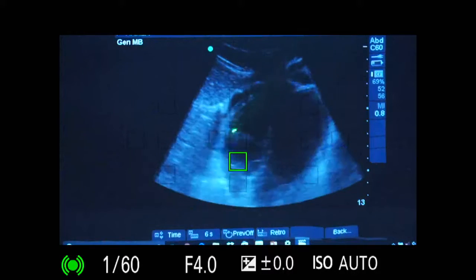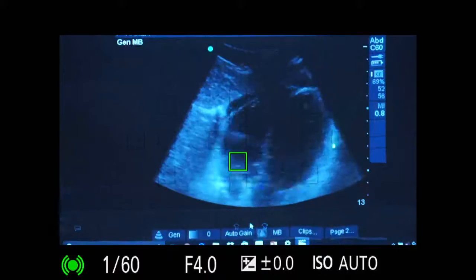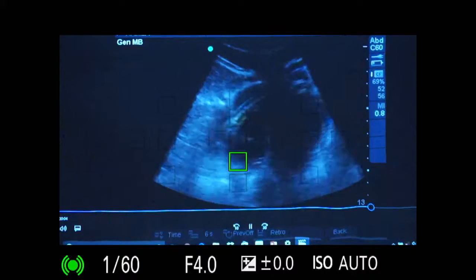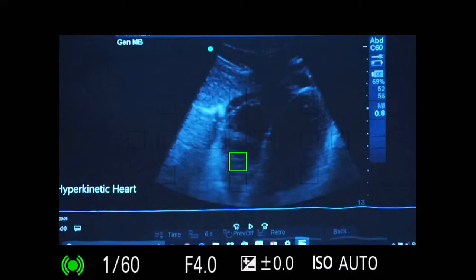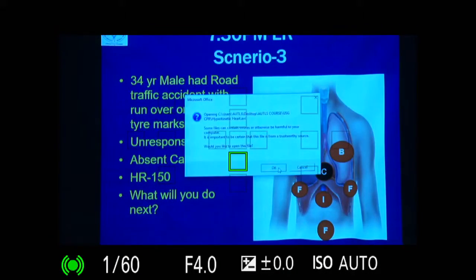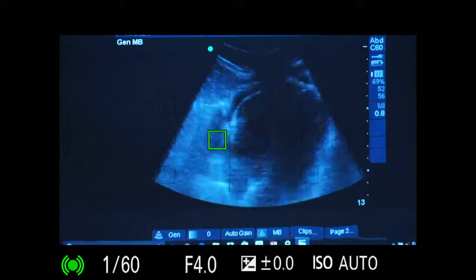If it is a pericardial effusion, usually unless it is loculated, it will be all around, in the dependent portion of the heart. You see, this is the pericardial pad of fat. Even that becomes anechoic. Remember this.